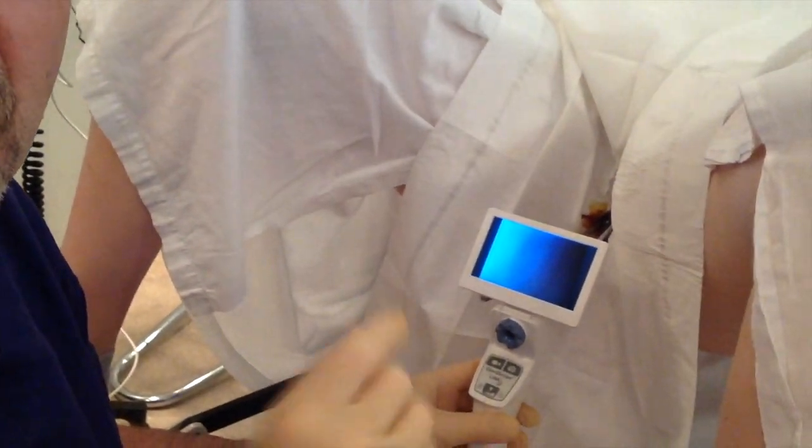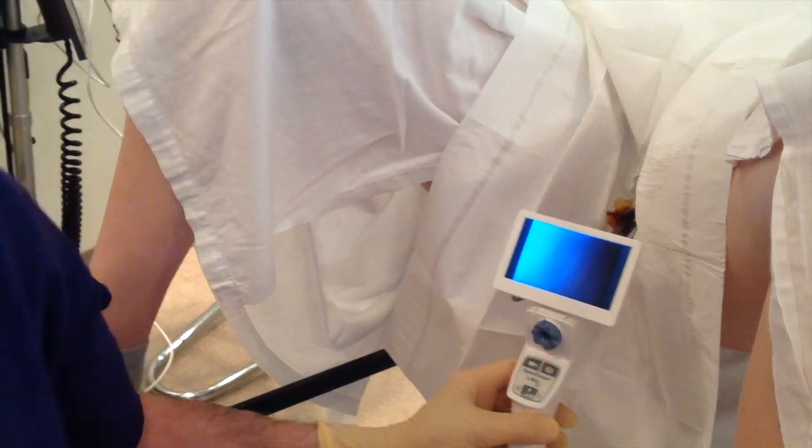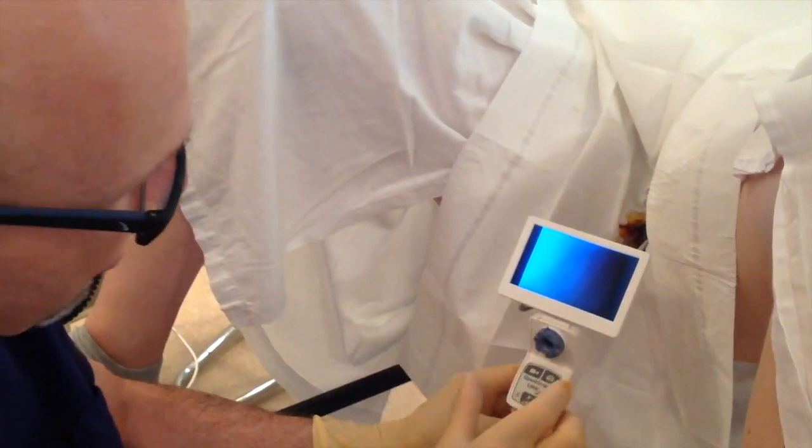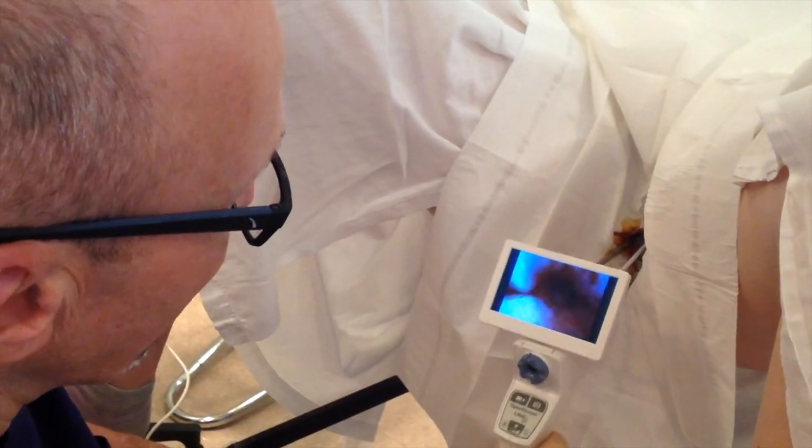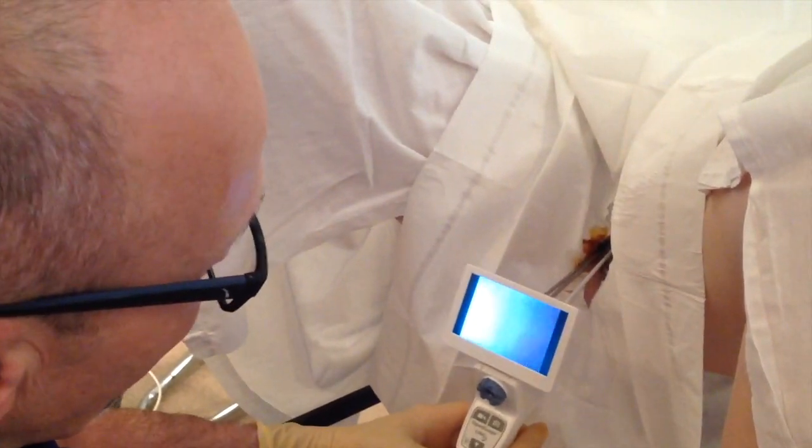So we're taking out an IUD using the new Lena Operascope — we're the first ones in New York to use it. We're removing an IUD that's embedded with the strings up inside. We do minimal dilation, and we have pure saline water running. We have a great picture — there's the cervix, and it's beautiful.